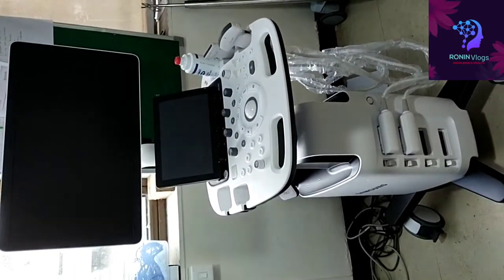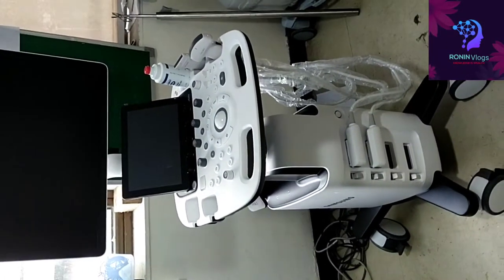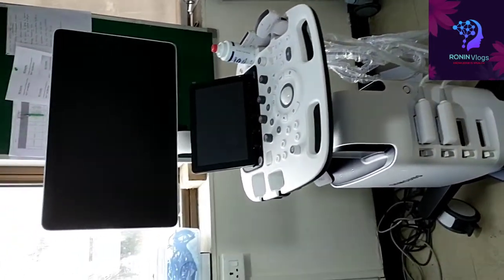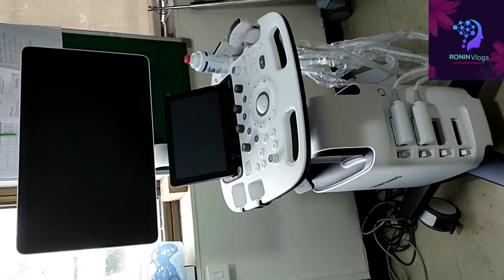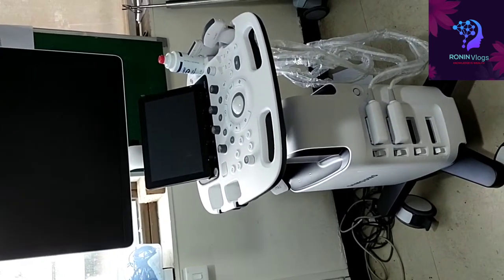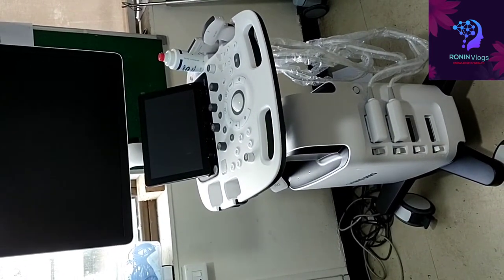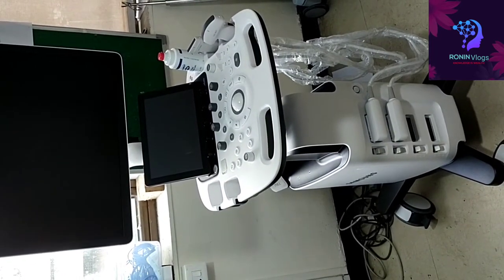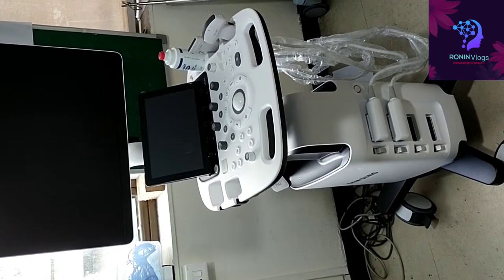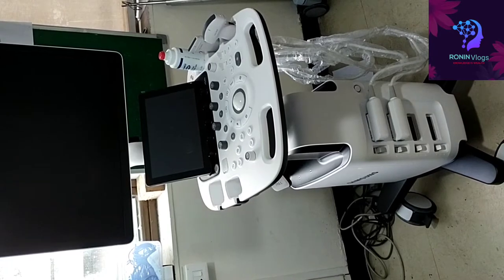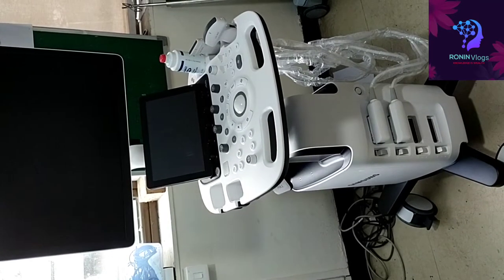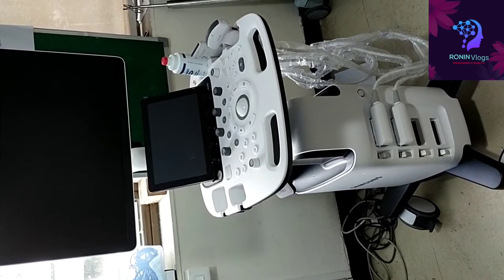Hello friends, welcome to my YouTube channel. In this video I am going to show you an ultrasound machine. It is Samsung company HS40 model.